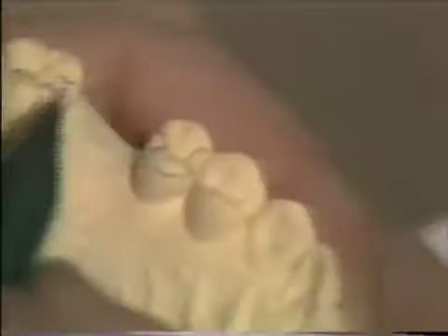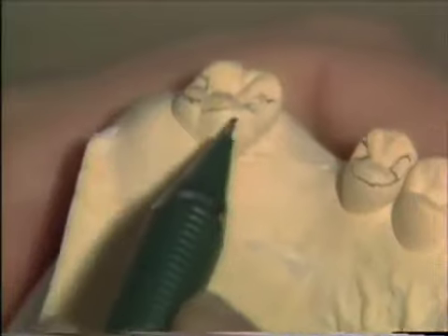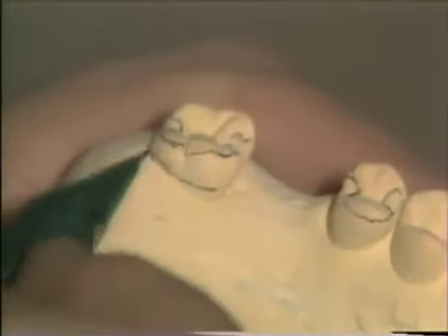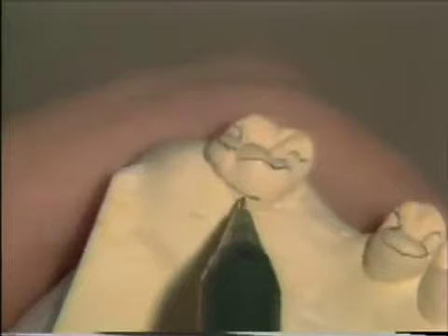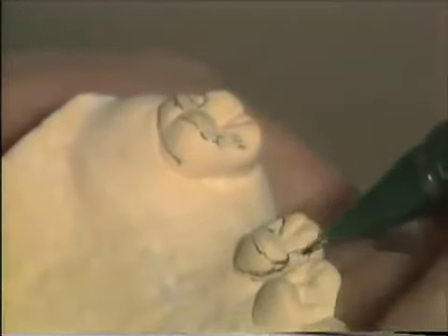On the molar, we are going to go to the lingual. Since this is a supporting cusp, we're going to stay away from the facets here and go around like that, staying about a millimeter away from the soft tissue. We will wrap around the tooth so we have at least 180 degree wrap around. On the bicuspid, there will also be a wrap around, thinning out so that we can get into that occlusal area right on the mesial.